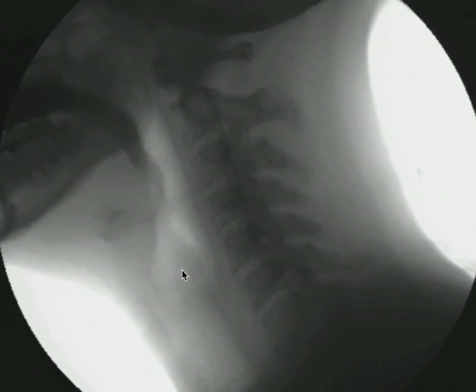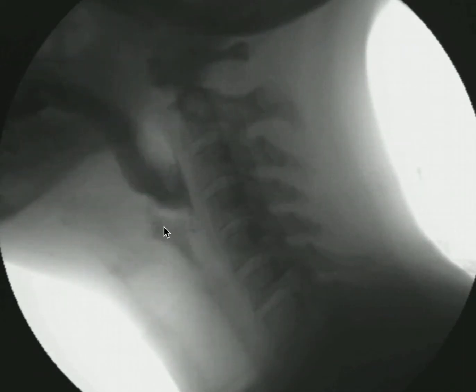Here they are, elevating, and we see the barium bolus coming down toward the valleculae, and then continue on and go down. Here we have our piriform sinuses, and it's going to continue to this point in the hypopharynx where we see the cricopharyngeus muscle right here.